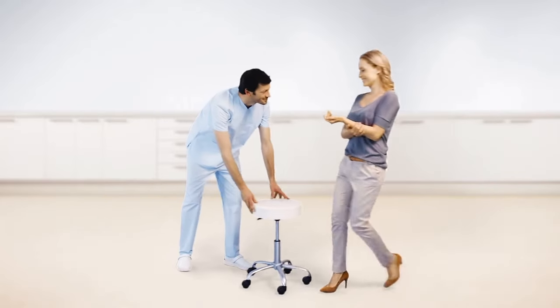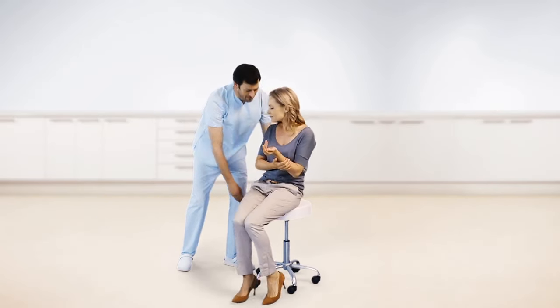To make their and their patients' life easier, BSN Medical has developed the Delta Dry product family.